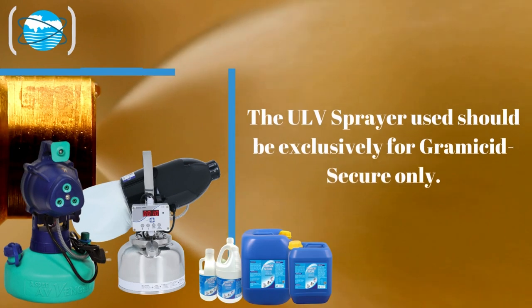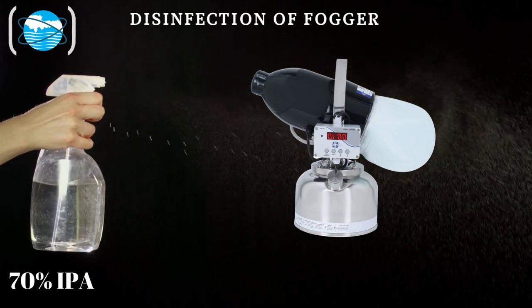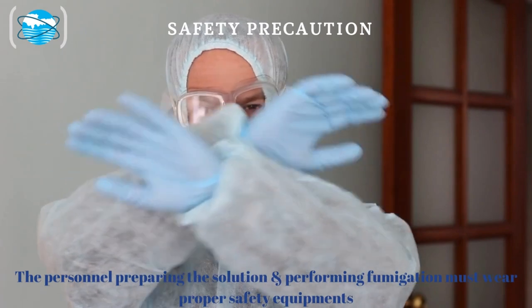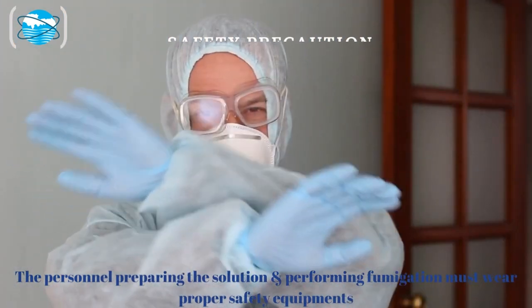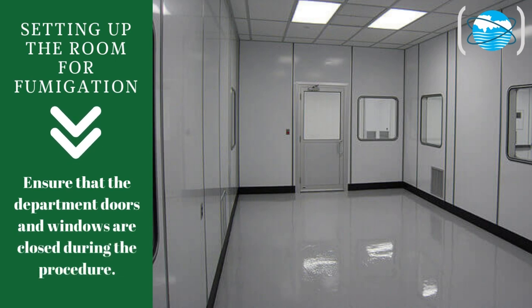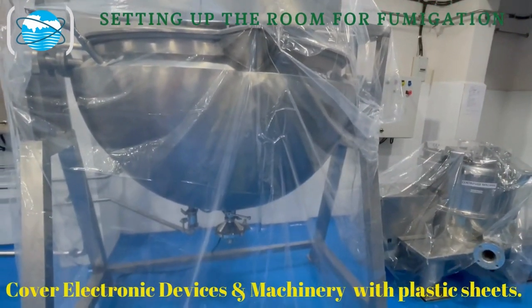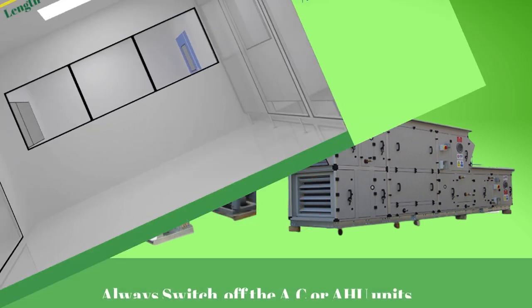Plastic or stainless steel ultra-low volume, or ULV, foggers should be used for disinfection. The ULV fogger should be exclusively used for Gramacid Secure only. Before spraying, the ULV body should be disinfected with IPA 70% solution. The personnel preparing the solution and performing fogging must wear proper safety equipment. Ensure that the department doors and windows are closed during the procedure.